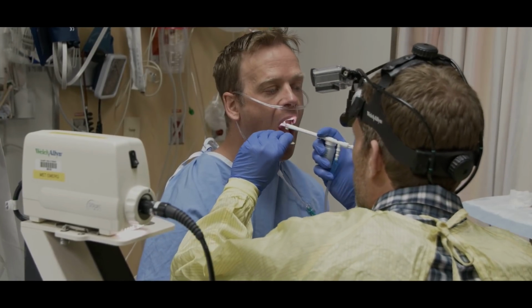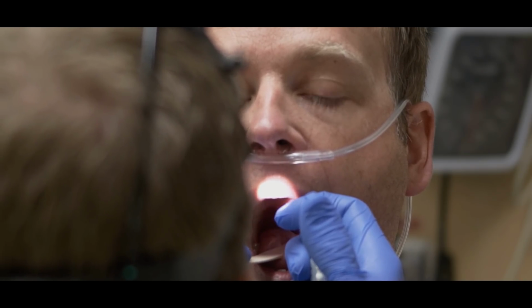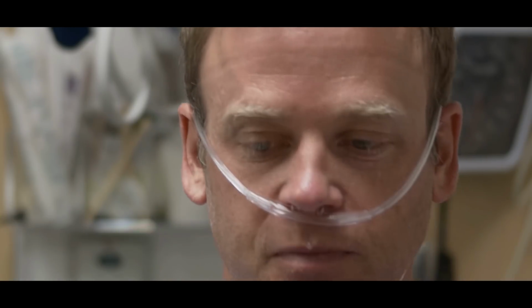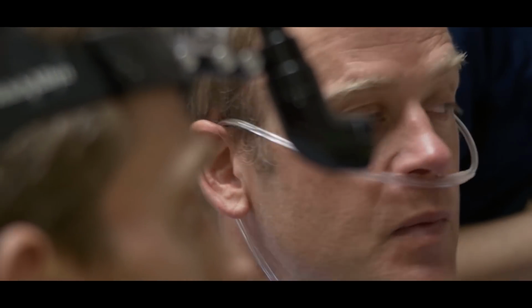You get a little more there. Same thing. You ready to inhale? A little cough. Okay. Yep. So if we can turn that off again, please? Thanks.